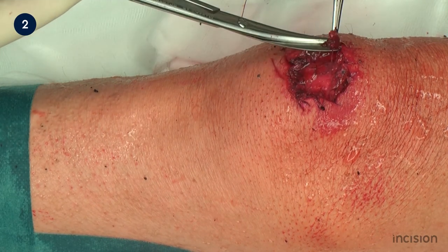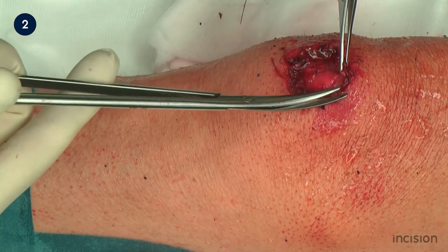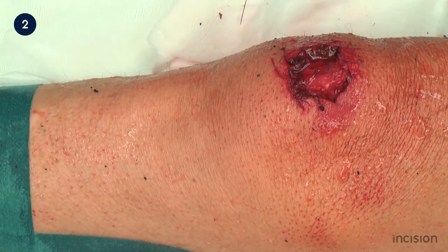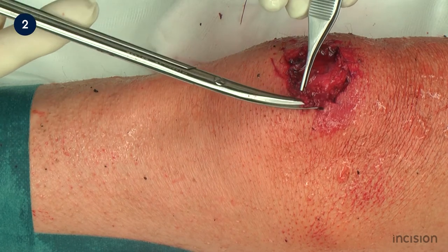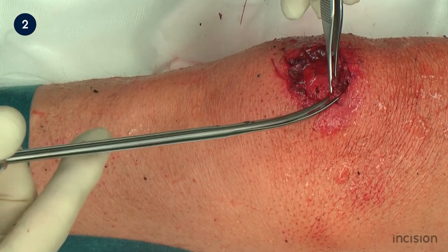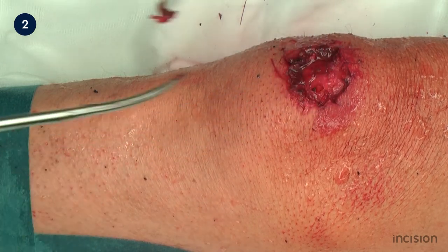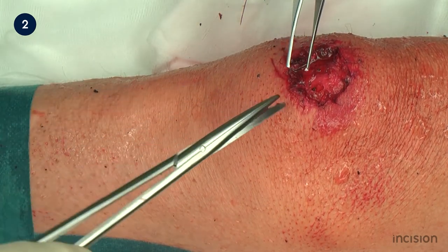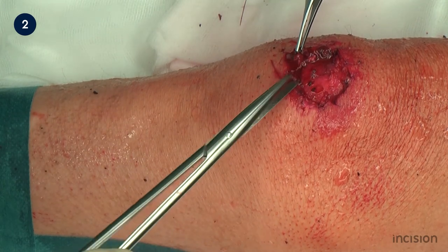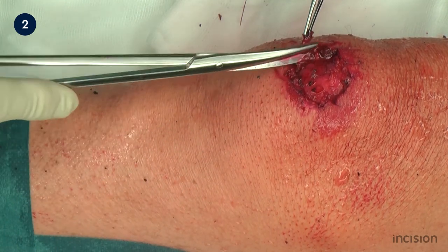The devitalised skin surrounding the wound and any crushed wound edges are then excised to give a clean, vital wound margin, in this case using scissors. To facilitate non-traumatic grasping, the wound has been wetted using normal saline solution. Only the tissue that is being excised should be grasped with the forceps, so as to prevent damage to healthy tissue.